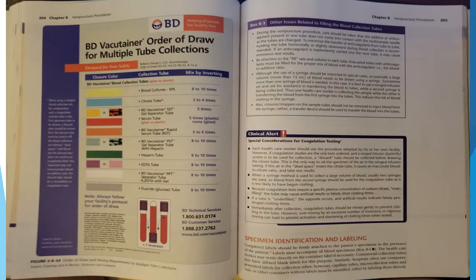times when tested. Specimen identification and labeling. Completed labels should be firmly attached to the patient's specimen in the presence of the patient. Labels must accompany all blood specimens. The healthcare worker may write directly on the container label if necessary. Commercial collection tubes may have affixed blank labels for this purpose. Similarly, hospitals often use computer-generated labels for collection tubes.